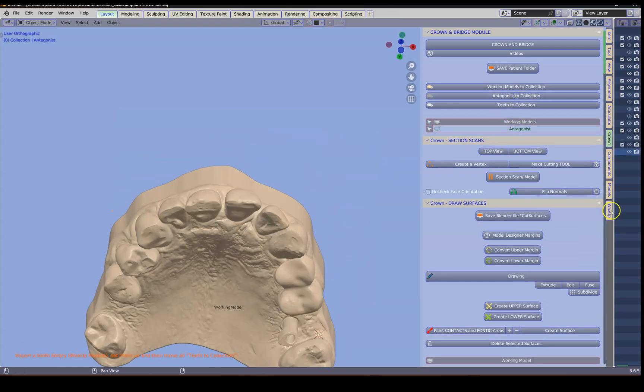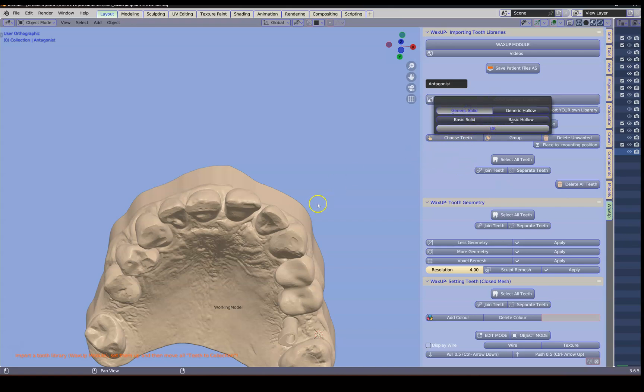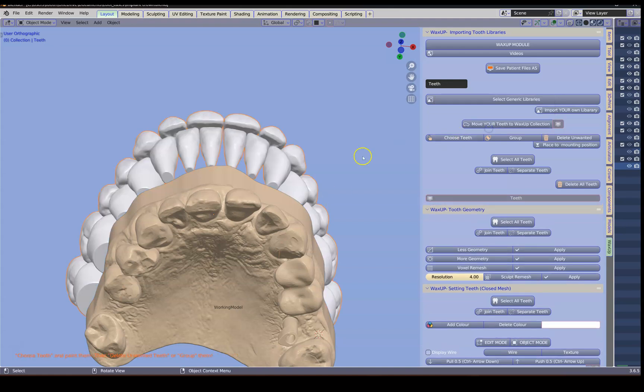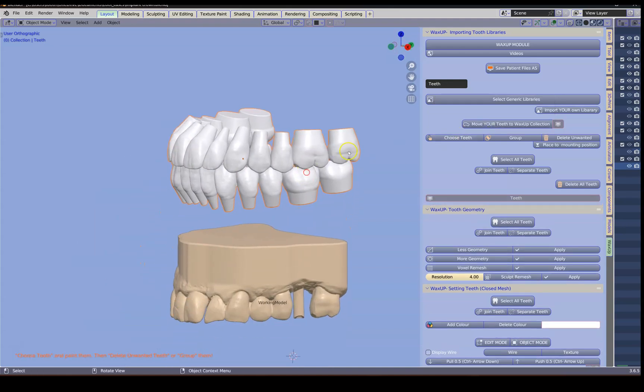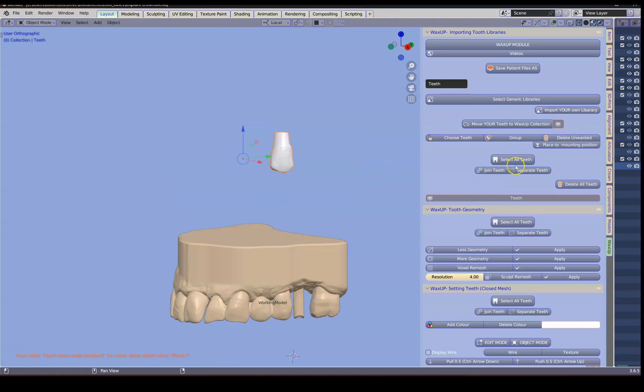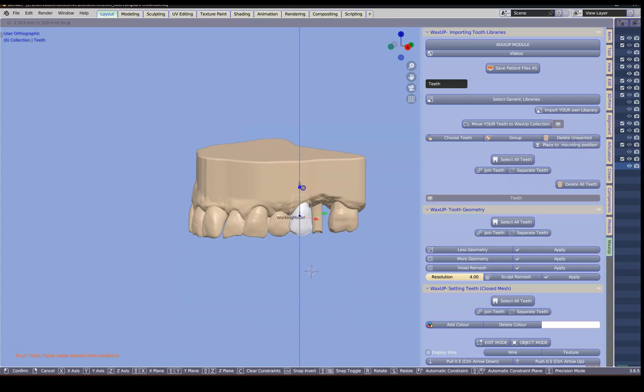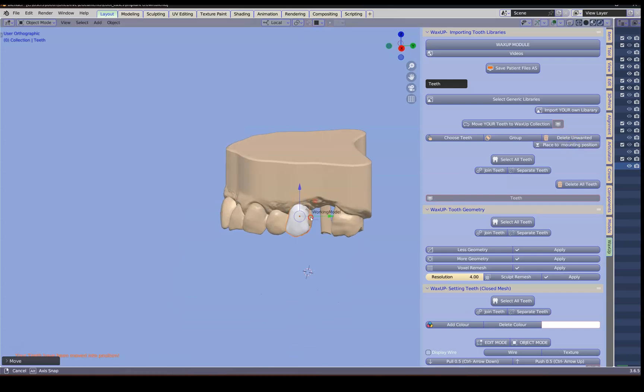We're going to go to the wax up module and bring in a tooth. Following that we're going to select the tooth that we need. So choose teeth, mark your premolar, delete the unwanted and place the tooth and then we're going to manipulate this tooth into position.